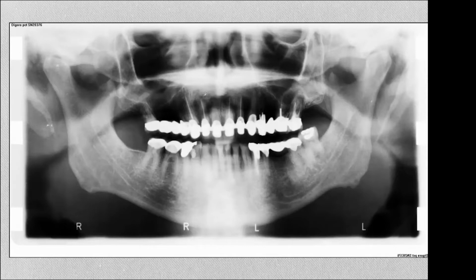In this case, for instance, we know that this patient has been having significant caries, been having pain, and is a diabetic. You wouldn't know that, but obviously we knew that. And his problem was mostly on the left side. As we see, this molar tooth, which was endodontically treated with sinus proximity, and yet we see this area right above the root of the molar that shows some separation or widening and sort of a cystic development. When we extracted this tooth, this area deflated, for lack of a better word.